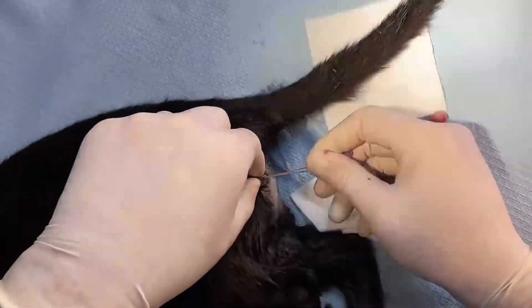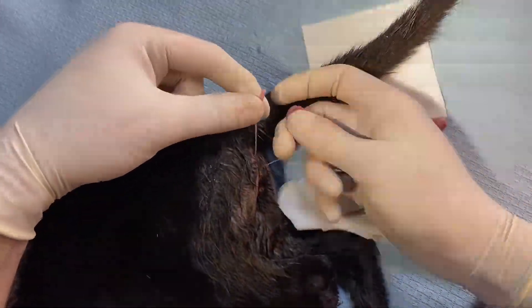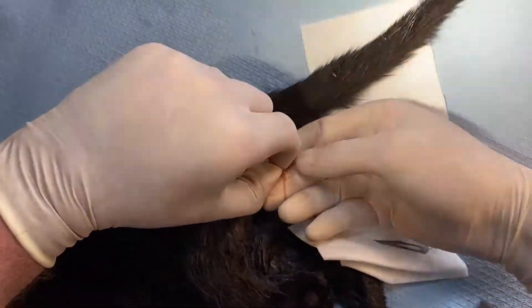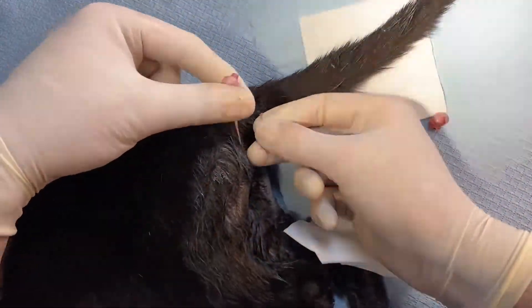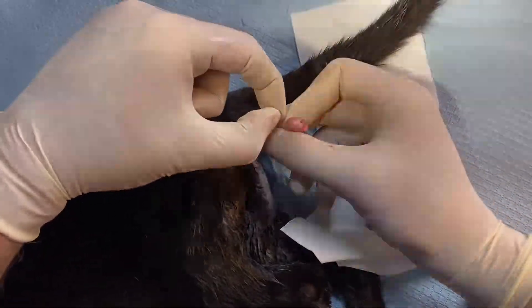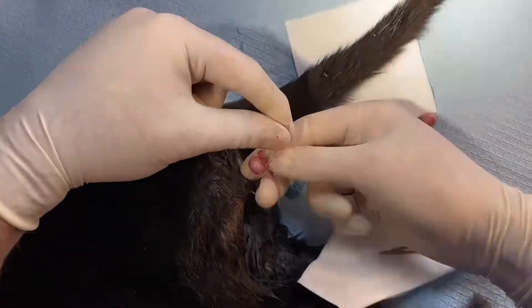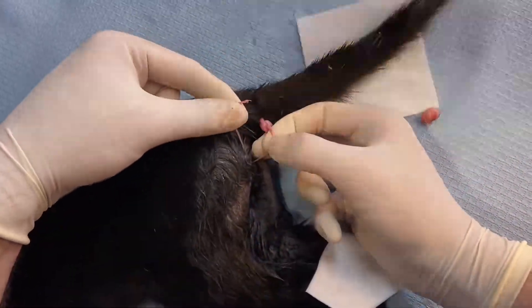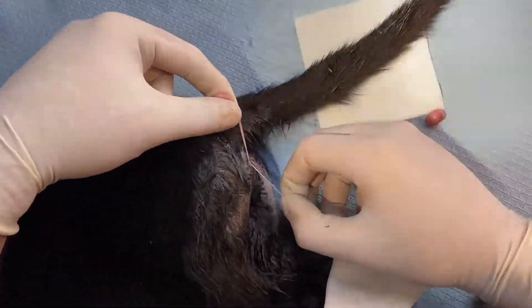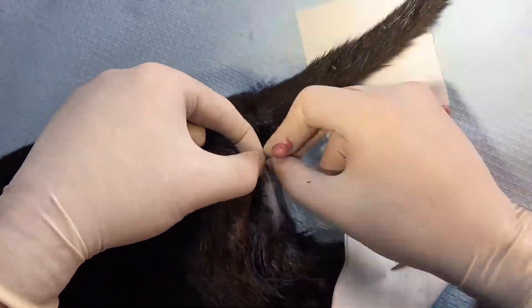Just check they're going in well — there's no skin attached to it or anything. There's no skin.